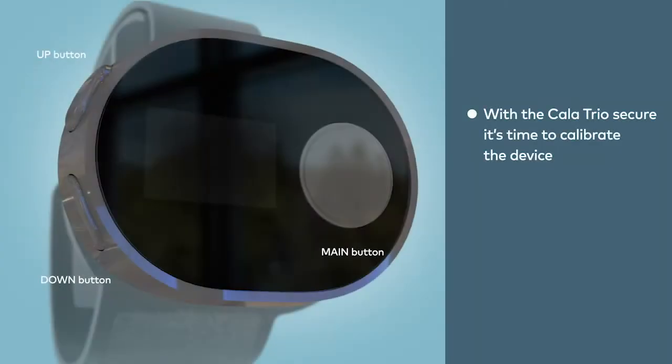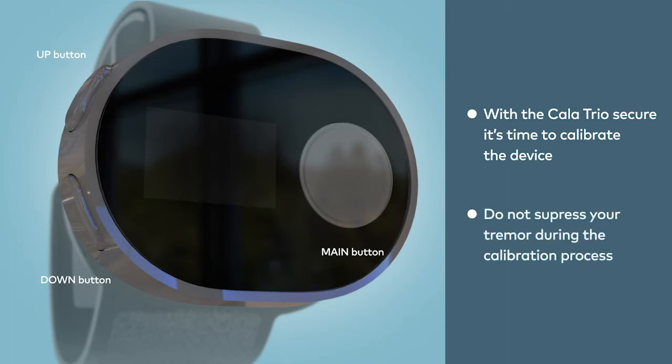With Calatrio now secured to your wrist, you'll calibrate the device. Because Calatrio analyzes your tremor, it's crucial that you not suppress your tremor during the calibration process.